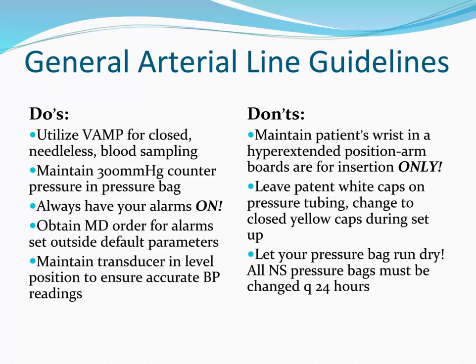Now, let's do the don'ts. Don't keep your patient's wrist hyperextended on the arm board. These are for the insertion only and can cause neuromuscular damage. Don't leave white caps on pressure tubing. Change to the yellow caps during setup. This can represent both an infection risk and a bleeding risk.